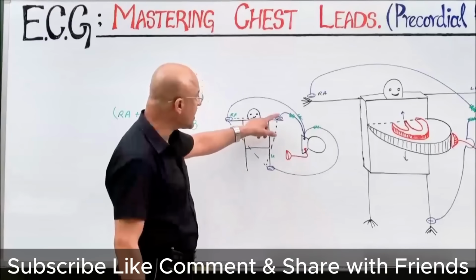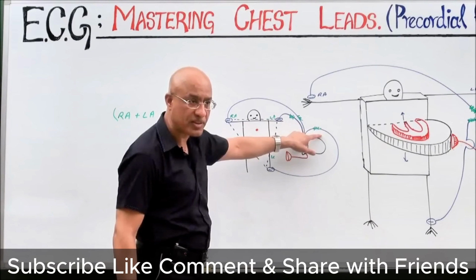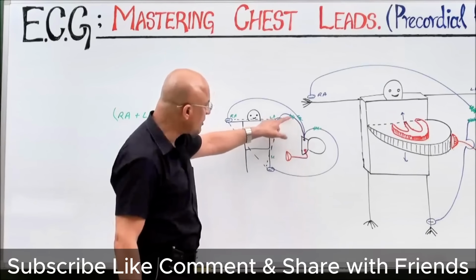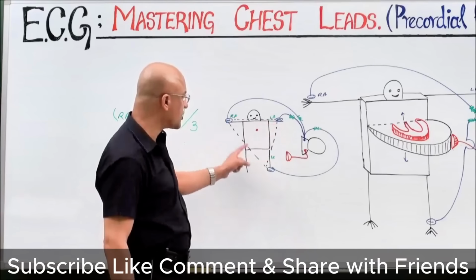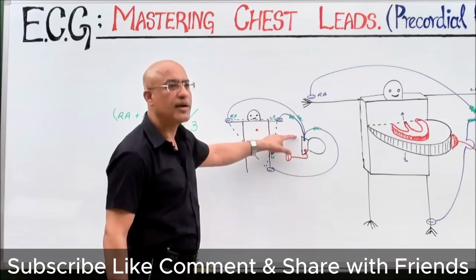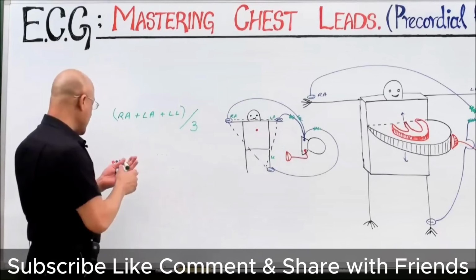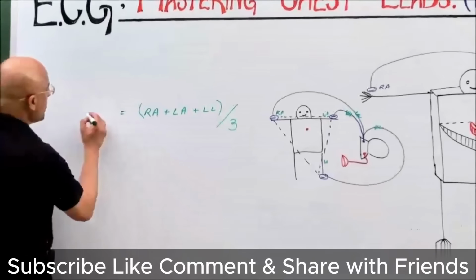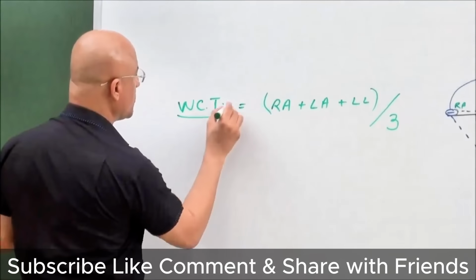To reduce that, we add 5000 ohm resistances. Now this negative terminal, which is averaging the potential of these 3 points, is called the Wilson central terminal. So we can say the Wilson central terminal potential is the potential detected by the Wilson central terminal.